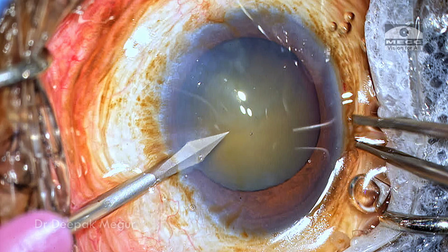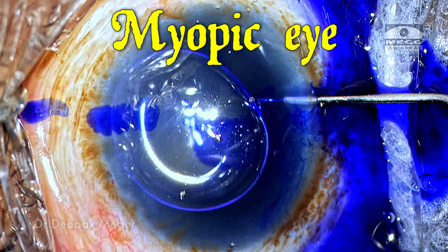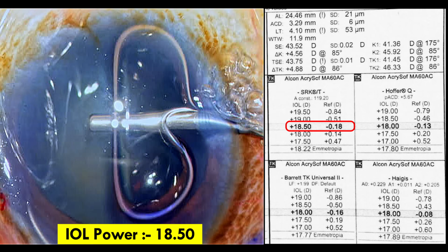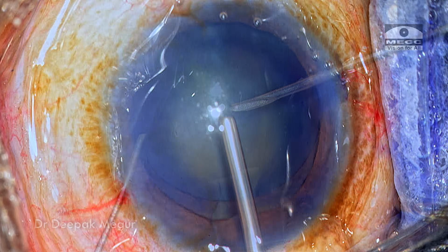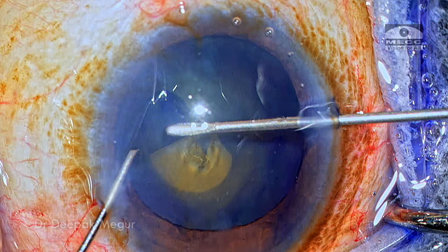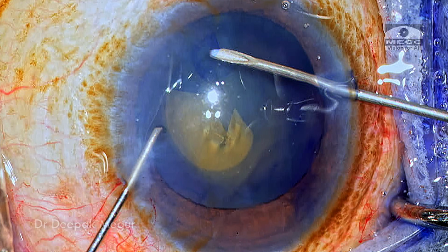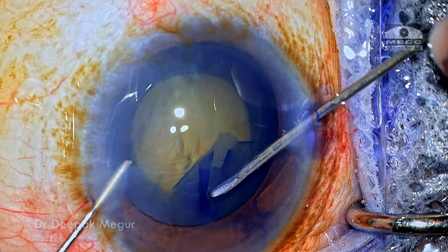Now, here is a 75-year-old gentleman who is undergoing cataract surgery. Patient is slightly myopic. This is the IOL power and the ocular biometry status, and the initial steps are alright. When I'm trying to do the rhexis, I don't find any exaggerated zonular weakness here, although it's not very strong, but it was relatively manageable.